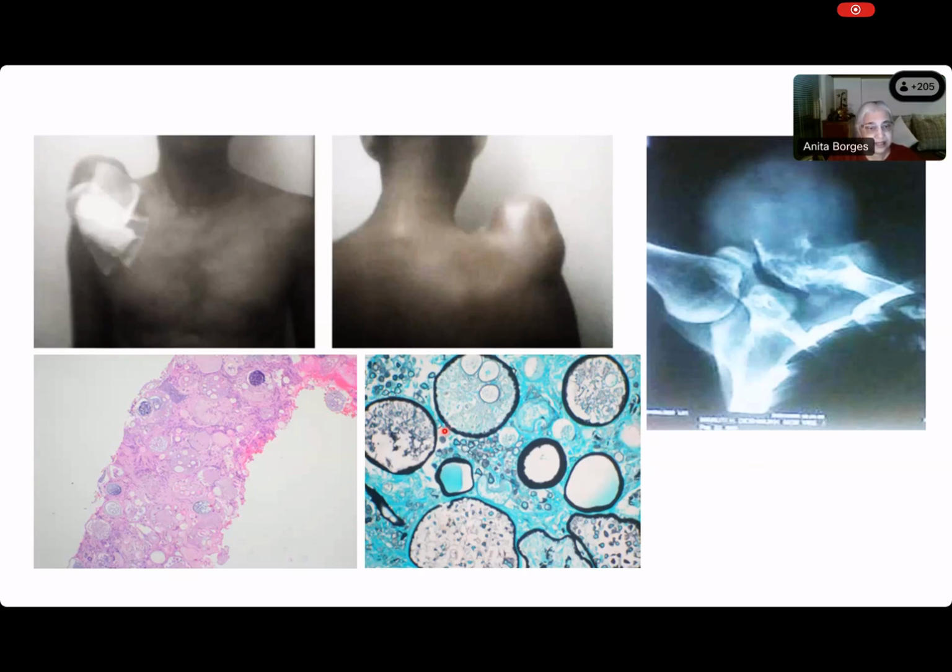Yes, and rhinosporidiosis normally occurs where, Prayas? Nasal cavity. And sometimes you can get it at some other parts of the body, where somebody who's probably been picking his or her nose then transfers this to the soft tissues at other sites. It is not at all so rare in countries where you have a lot of rhinosporidiosis to come across extranasal rhinosporidiosis. So this is rhinosporidiosis in bone. Okay. So there you are. It happens, and it also looks like it is a malignant tumor because multiple bones are destroyed, but this is rhinosporidiosis. Very good. Excellent, Prayas.